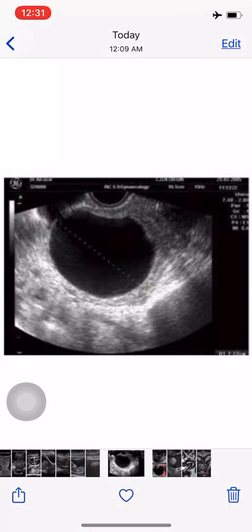عندنا two types of ultrasound اللي نسويه، يا اما trans abdominal أو trans vaginal. شنو الفروقات بينهم والadvantages والdisadvantages؟ Trans abdominal requires a full bladder, which is a disadvantage. You need a full bladder, يعني to use the bladder as an acoustic window to the pelvic organs. لأنه إذا the bladder is not full, the bowel loops fill the pelvis وبعدين gases, it might be difficult to assess the pelvic organs.